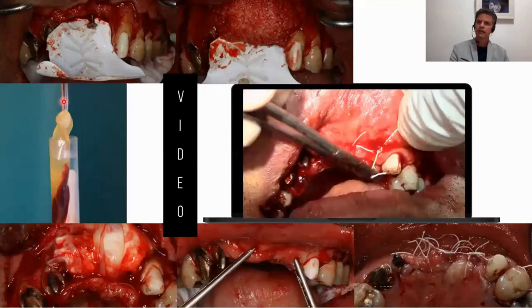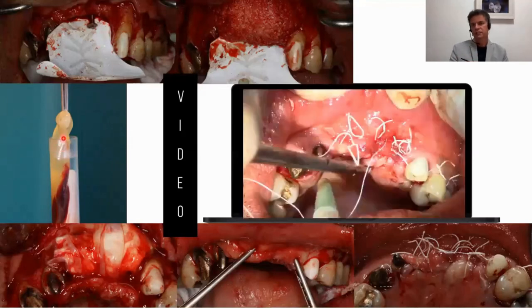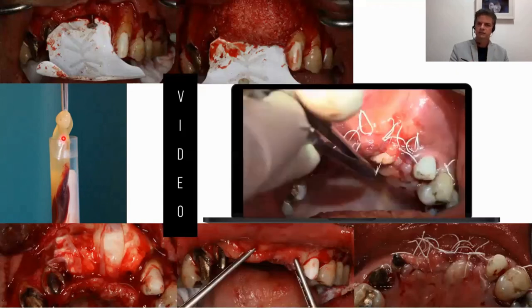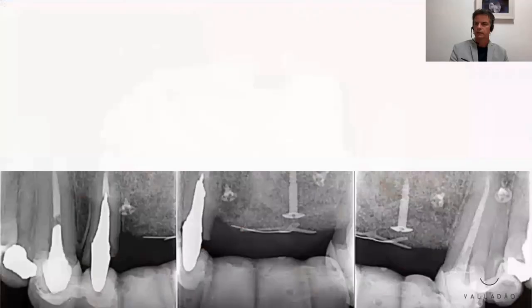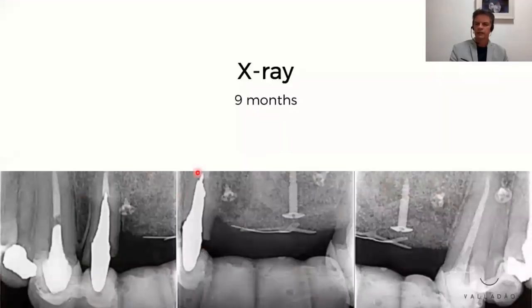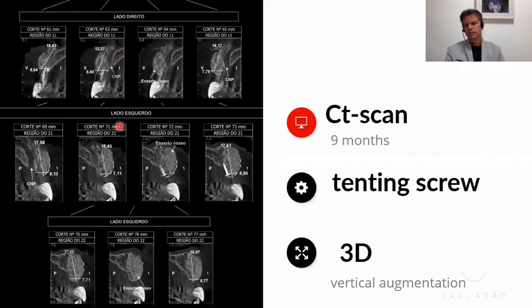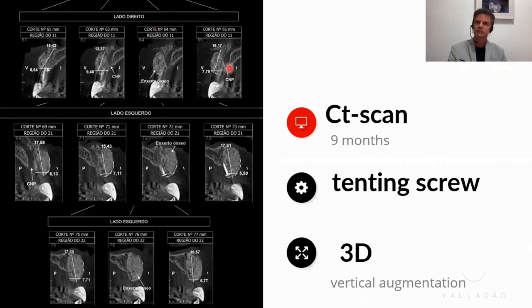The L-PRF membranes were also obtained from the patient's blood after centrifugation at 2,700 RPM for 12 minutes. The periapical X-ray after nine months shows everything looks fine. These are the CT scans after nine months. In the CT scan, we can notice even greater bone volume than that of the first surgery. The tent screw is visible in position in the middle image.